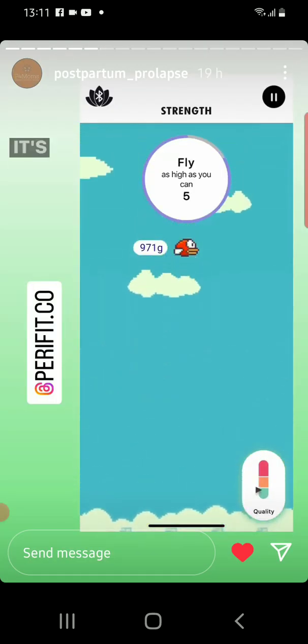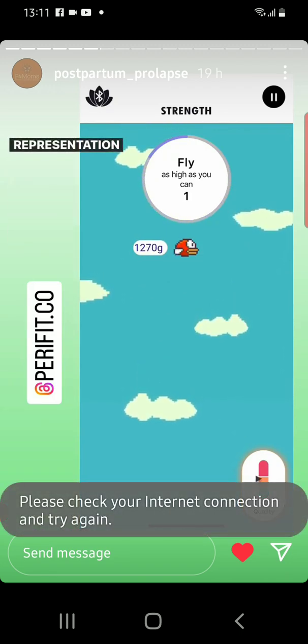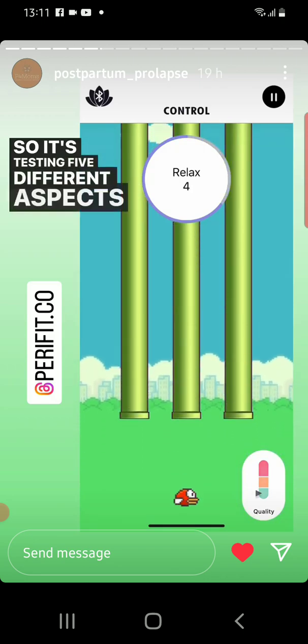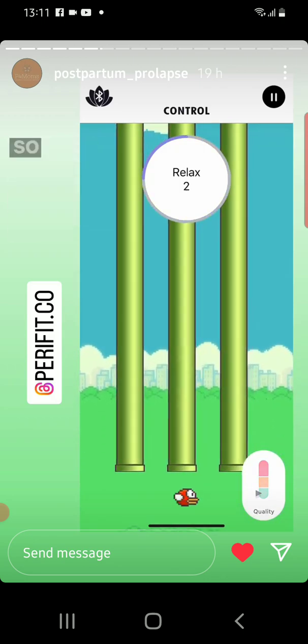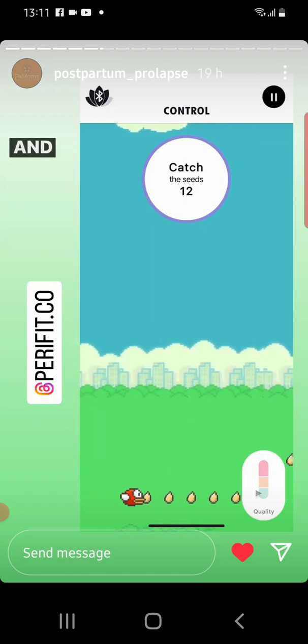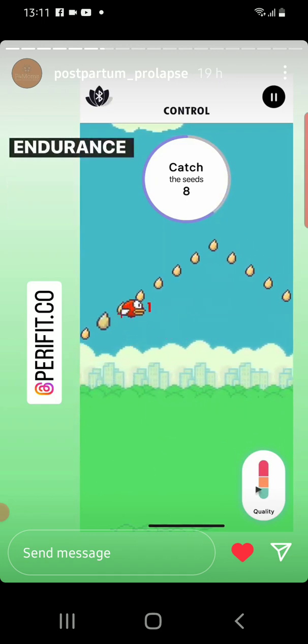So this one was pretty cool. It's actually going to show us what they call a 5D representation of the pelvic floor function, so it's testing five different aspects and you'll see it mapped out at the end. So that one was my ability to hold a strong contraction, and now it's kind of my ability to coordinate, to have endurance — to hold and then slowly relax.